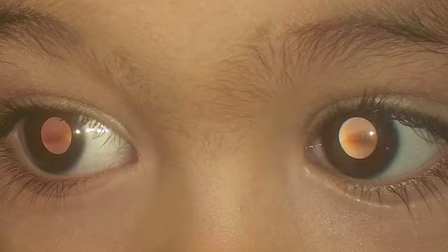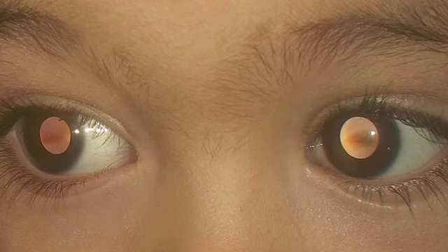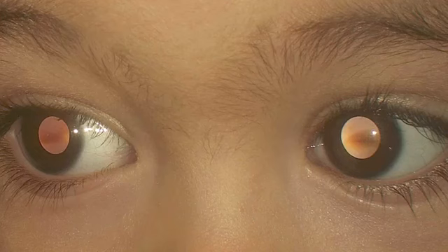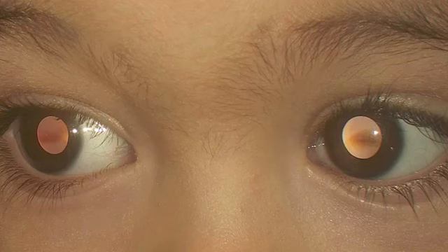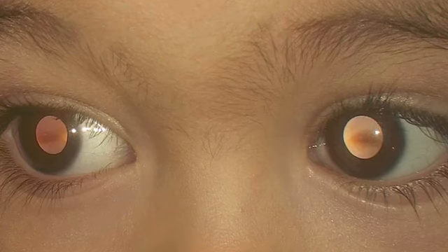Here is another normal child with a normal red reflex. The child isn't looking directly at the examiner, and that causes some asymmetry between the two eyes. But even with the asymmetry, both eyes appear normal, with a yellow or orangish reflex that's fairly homogeneous throughout. You may notice in the child's left eye on your right a little bit of a yellow crescent at the edge of the reflex, which is also acceptable.